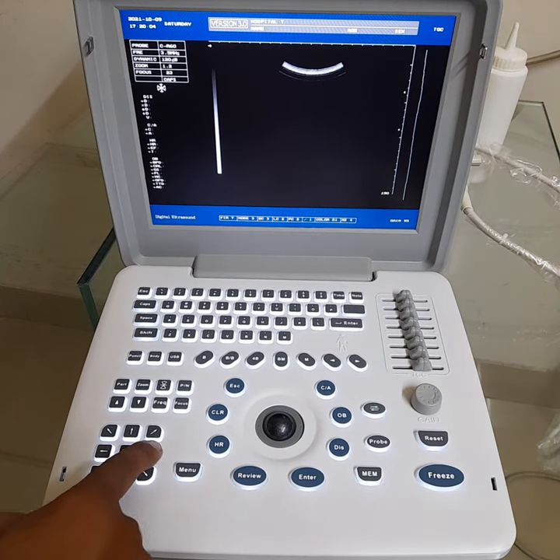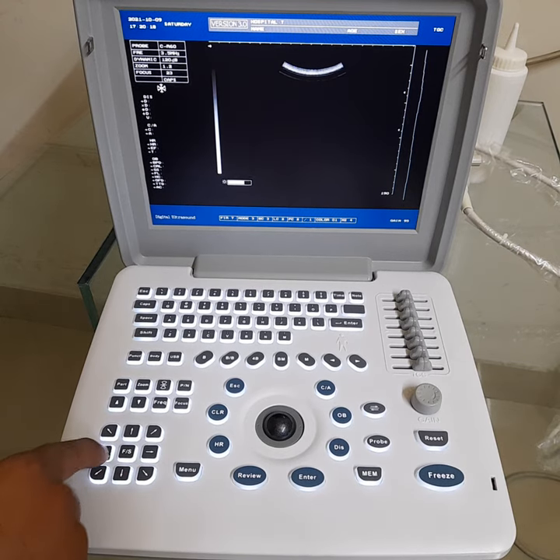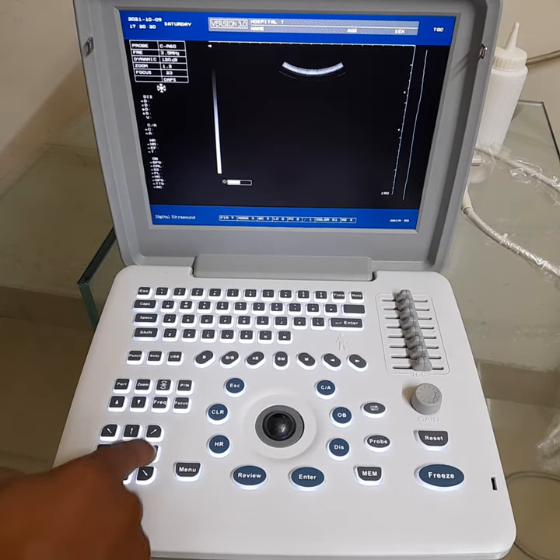Brightness Increasing. Increase, Decrease — Brightness Decreasing. Brightness Increasing.